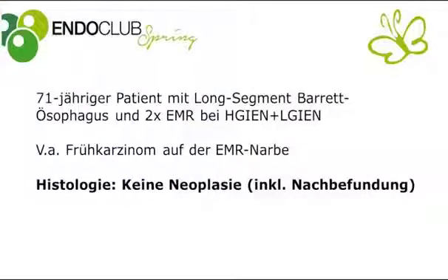Histological examination of the ESD specimen showed no neoplasia, and this was confirmed by the follow-up report. So a biopsy carcinoma must be assumed, and the patient will be receiving further endoscopic and biopsy monitoring.